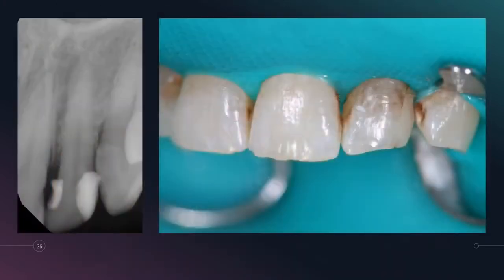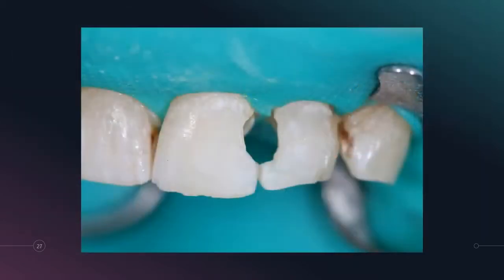Now, this is the last case I'm going to show you before we do a little bit more hands-on stuff. This is what I would consider everyday dentistry for me. Patient walks into the office and they have this overhang on number 10, and that overhang's caused all kinds of problems for number 10. That composite's breaking down. It's also caused decay on the distal of number 9. And so I'm going to fix that situation here. And this is kind of a prep that's subgingival on both teeth.